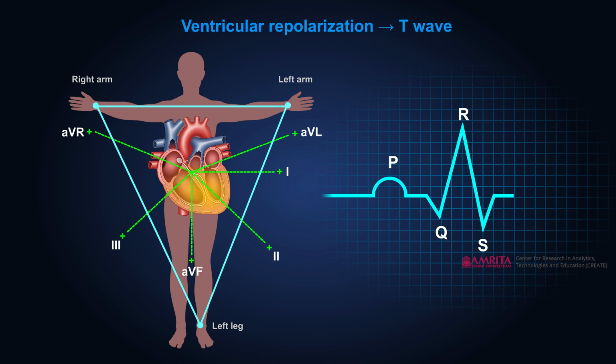Repolarization begins in the region that depolarized last. The wavefront moves upward, but charge reversal makes the T wave positive.